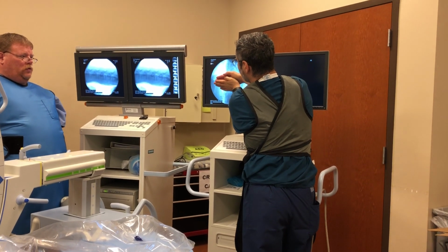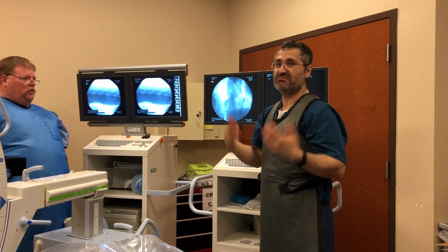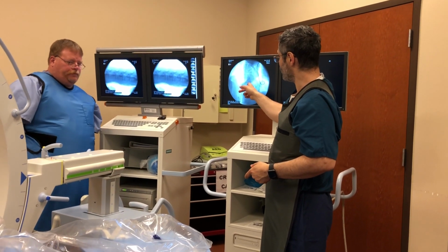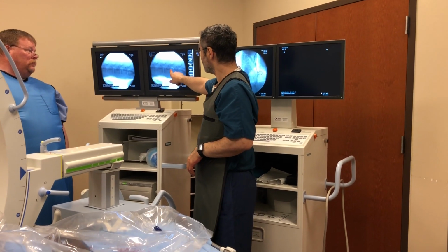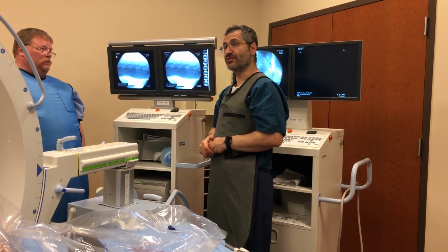But if you get the end plate here, like that or like that, as long as you see that, it's workable. Because you just want to know how far from the lateral aspect you are. That's all you need to know from that. In the lateral view though, you need to see the end plate because that gives you an actual trajectory.